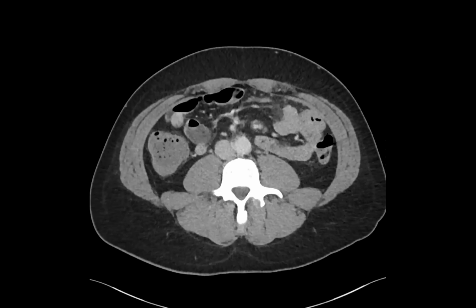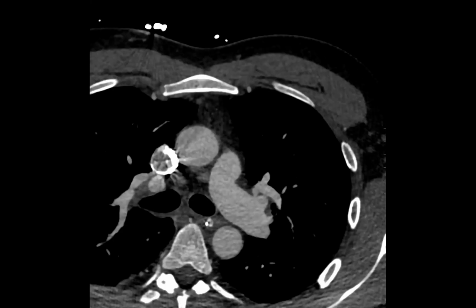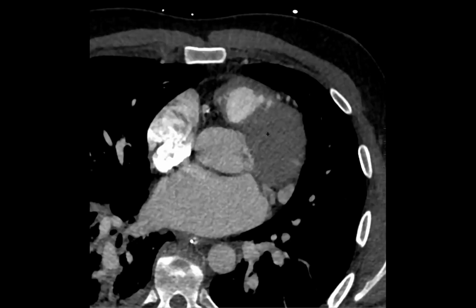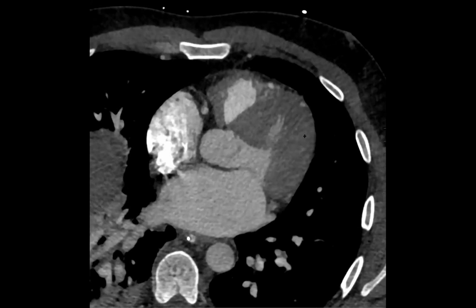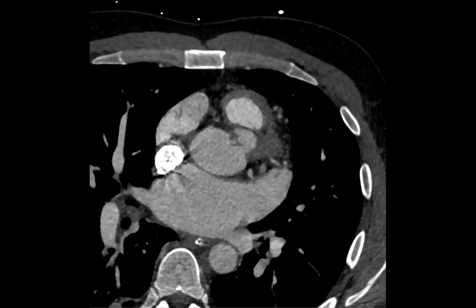So this patient has congenital bicuspid aortic valves, and then had aortic vegetation. So that's septic thrombus, and there's a pseudoaneurysm here coming off the aortic root. Wow, that also looks scary. Super scary. I haven't seen an embolus to the SMA since I was a resident.